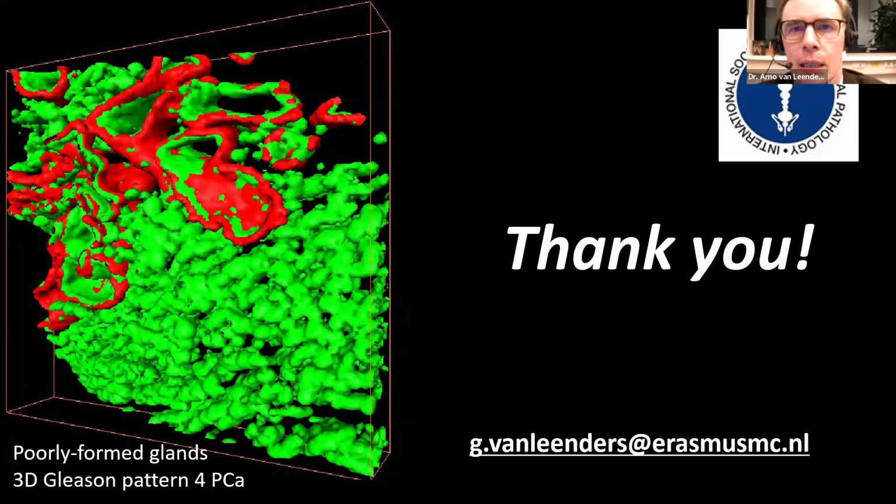Okay, the criteria of distinguishing AIP and IDC: IDC is generally a dense cribriform. In IDC, you will have a dilated pre-existent gland with a dense cribriform pattern. So that means there are more atypical epithelial cells than there are lumina. In AIP, it's the other way around.